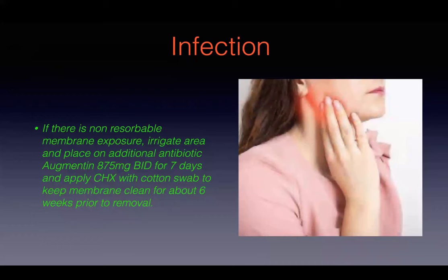Are there times when you would bone graft without a membrane or collagen plug? Is it bad to have bone stuck in the tissue? The only time I really see that is if you have a patient who's not a very good healer, they probably have some other comorbidities, and you go in there even at 5 months, 6 months, and you find some bone particulate stuck to the soft tissue when you've done the flap. That's happened to me. So I hope I've answered your question.